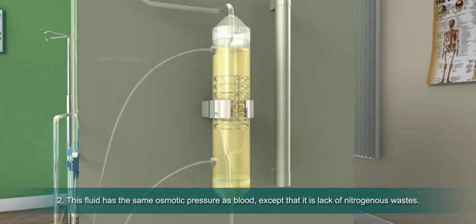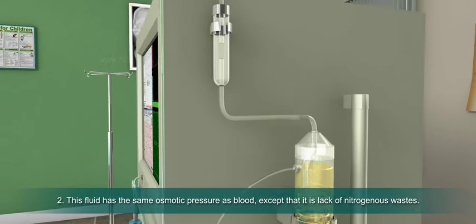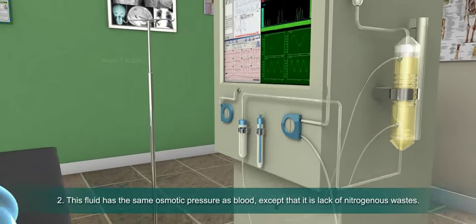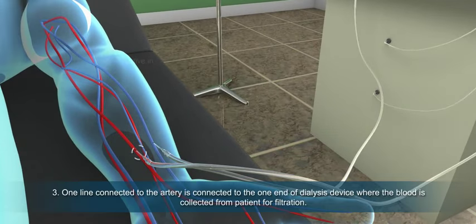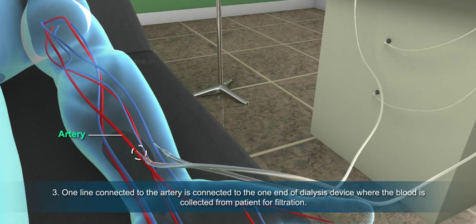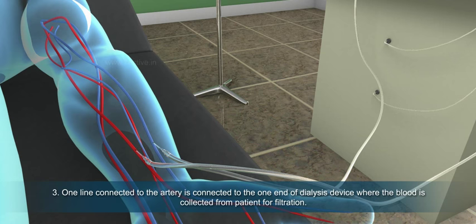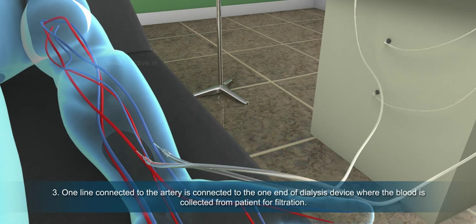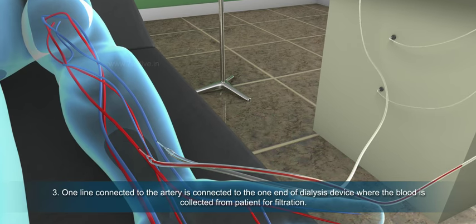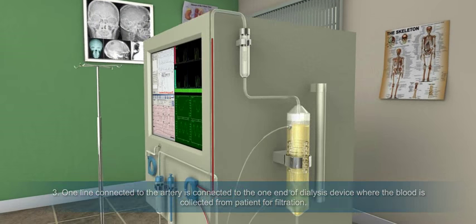The dialyzing fluid has the same osmotic pressure as blood, except that it lacks nitrogenous wastes. One line connected to the artery is connected to one end of the dialysis device, where the blood is collected from the patient for filtration.